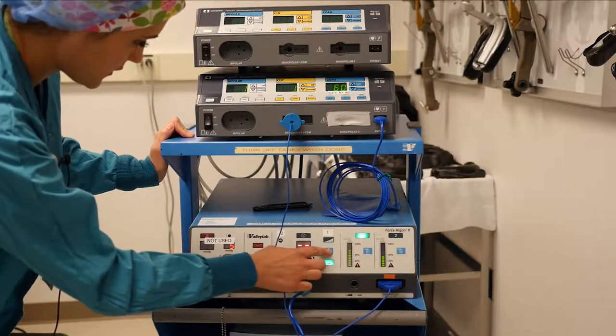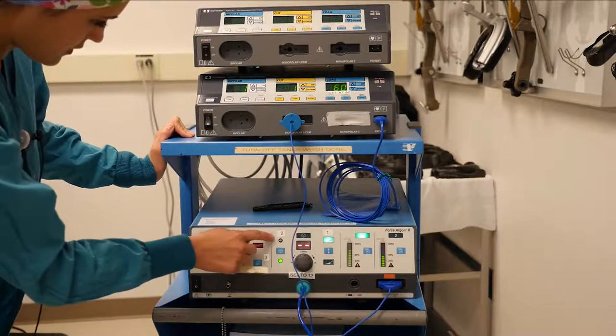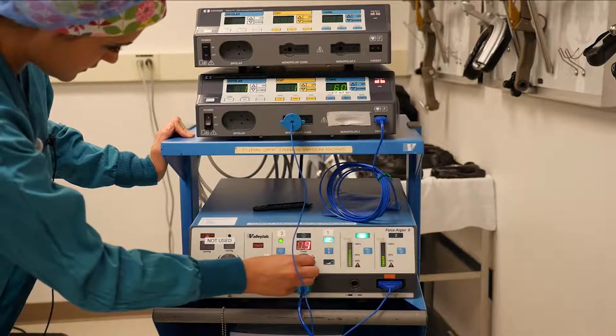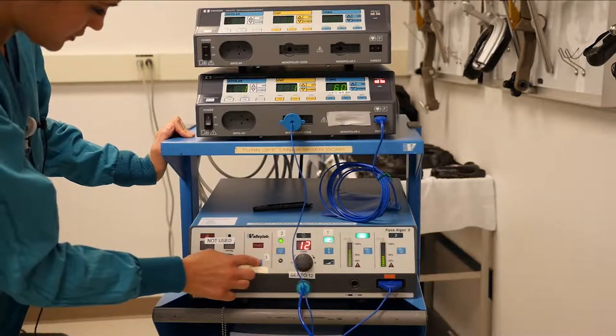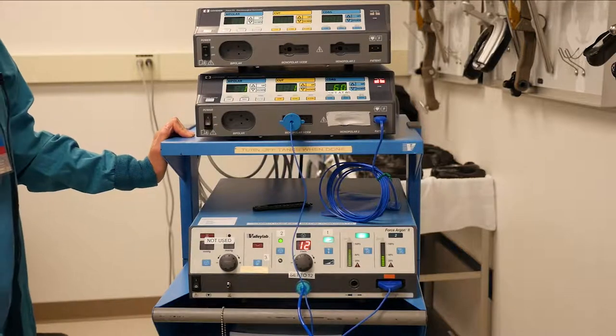This blue button here is the first one you will press — it has number one here, number two. And then you will set this to 12. Then you'll purge the line. And now it's ready to use.